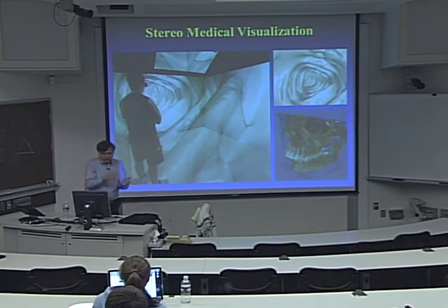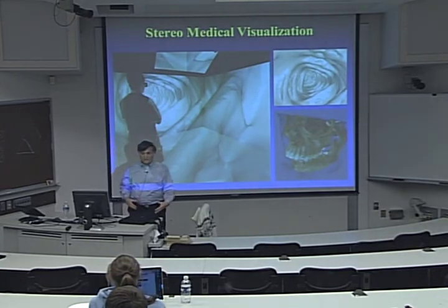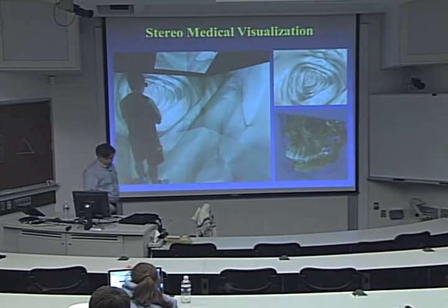Again, this is a prototype. We started to work with 3 radiologists, saw that, and they liked it, but we're not sure exactly how this will work out. Maybe with a swivel chair in the middle, because they can also look backward and see what they missed. We don't want them to get lost, so you have to give them some kind of an orientation and directions there.